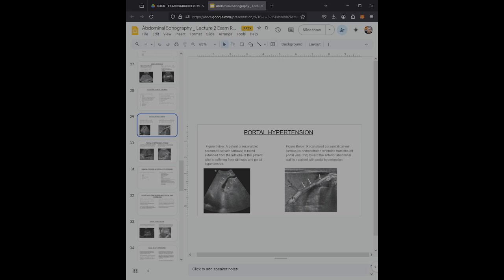And we may begin to see certain portosystemic collaterals develop, and certain varicosities, as a result of the body's attempt to compensate by channeling blood away from the damaged liver. So certain examples of portosystemic collaterals would include the coronary vein, a short gastric vein, a gastrorenal pathway, a splenorenal pathway, an umbilical vein, an anterior abdominal wall vein, or a superior mesenteric vein.